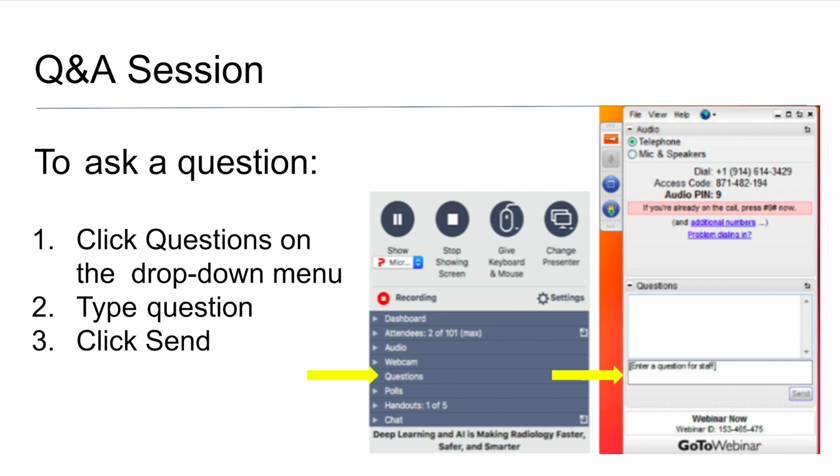So there is definitely improvement that can be done pre-DICOM and also post-DICOM. In the interview we talked about this technology as mostly post-DICOM because we also wanted to generalize for different scanners and even different tracers, different body types and applications. So we try to make sure it's generalized. DICOM is definitely a very standard format that everyone uses, so it can give us a standardized way to process images.